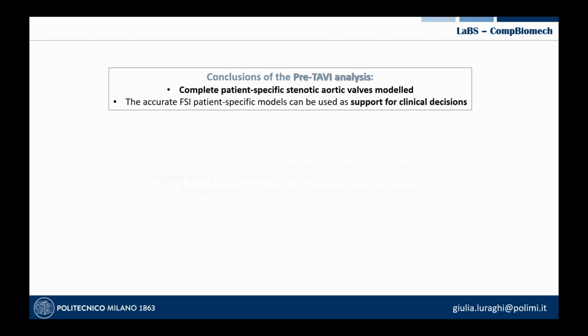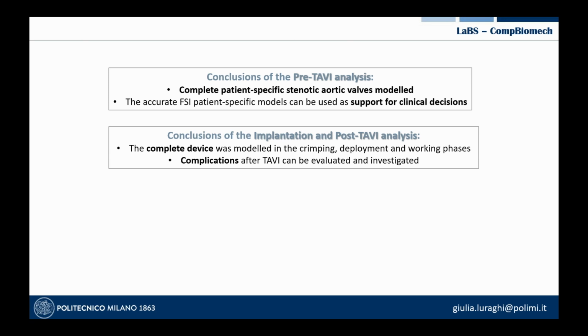So this is the first application. In conclusion, we developed a complete patient-specific model of the stenotic aortic valves. We built a strong FSI simulation to be able to reproduce the pathological hemodynamic condition. And then we built the structural deployment, the implantation of the aortic valve. And then with an FSI, we can reproduce the post-TAVI procedure and evaluate the complications after TAVI from both the structural and hemodynamic point of view.